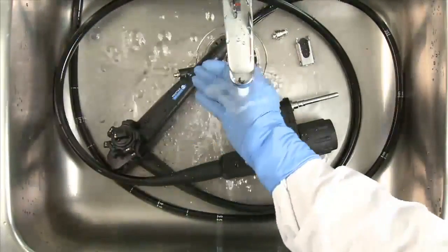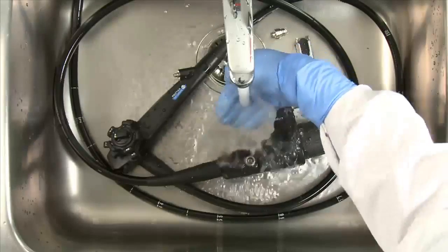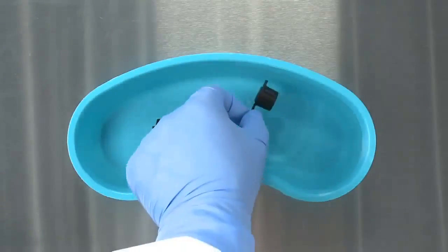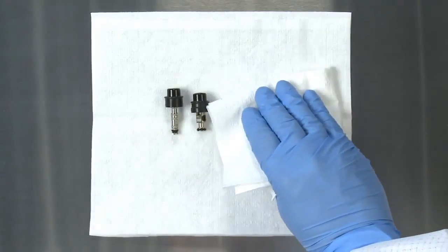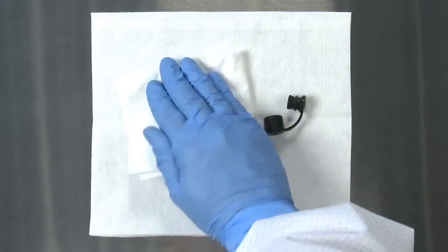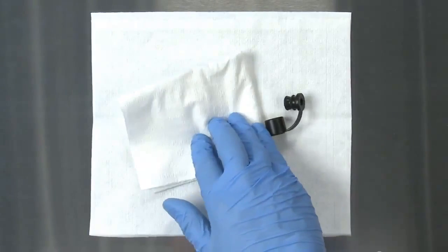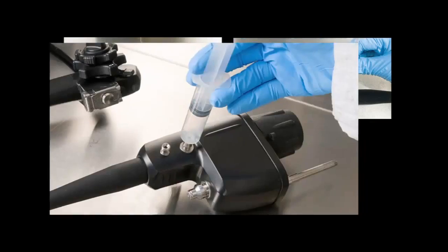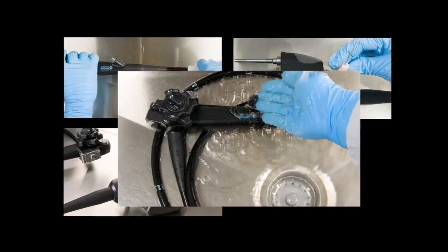Empty the basin and rinse the external surfaces of the endoscope with running water. Clean, rinse, and dry all removable scope components. Remember that PENTAX recommends autoclaving all removable components when possible. Note: the manual cleaning of the endoscope should be completed within 1 hour of procedure completion.